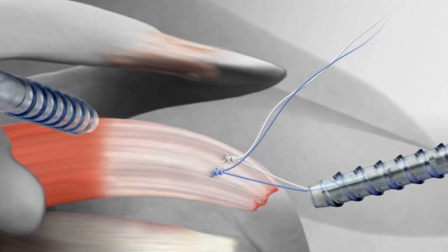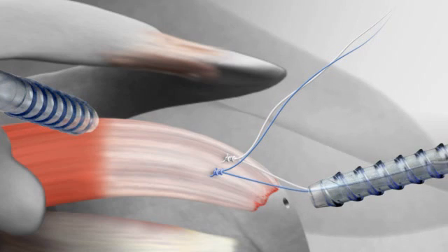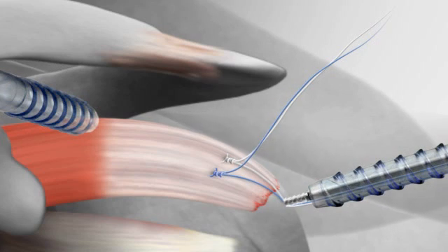The surgeon then creates two additional sockets laterally. Sutures passed previously are crossed and secured to the bone using knotless push lock anchors.